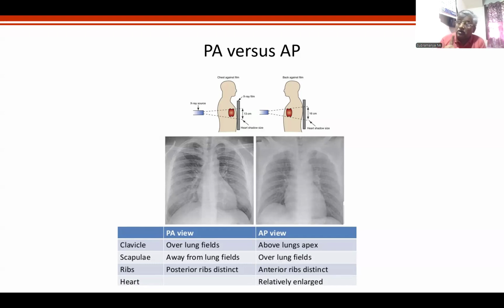I can give you a number of examples, but it is sufficient for you to know AP versus PA because cardiomegaly, size of the vessels, and apparent positions of various structures can be factors that influence you. This is not a problem for an adult physician, but a definite problem for a pediatrician when interpreting the X-rays. And most of the X-rays are done in infancy.